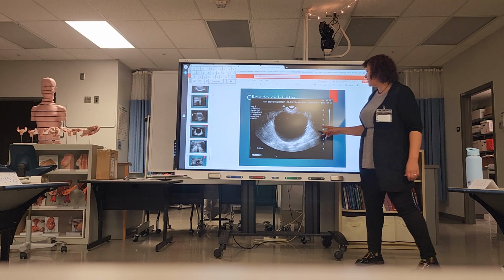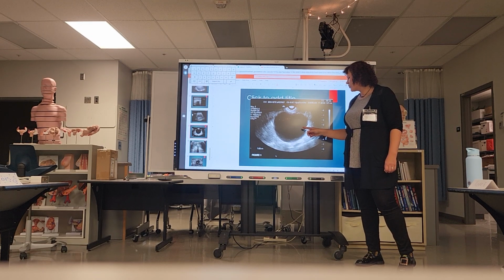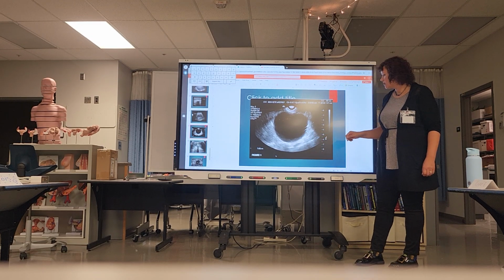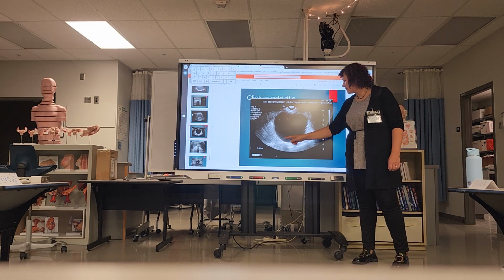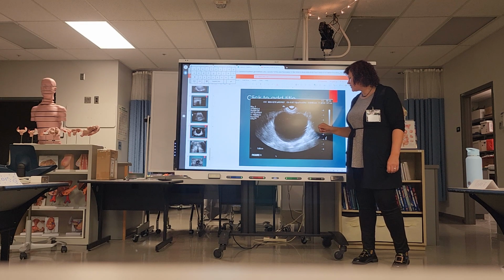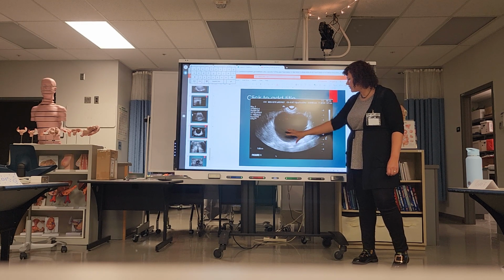All right, what about this? How would you describe the echogenicity here? Anechoic, good. And then what about the borders? Well defined. Well defined, okay. And is this a solid or is it cystic? Cystic. Cystic, yeah. There are no echoes in here.